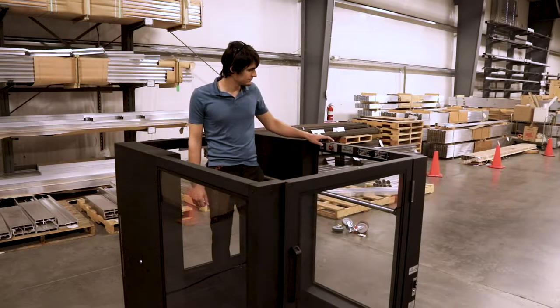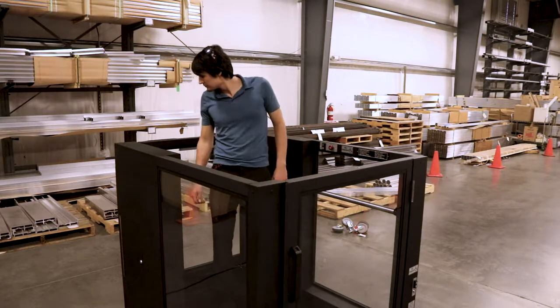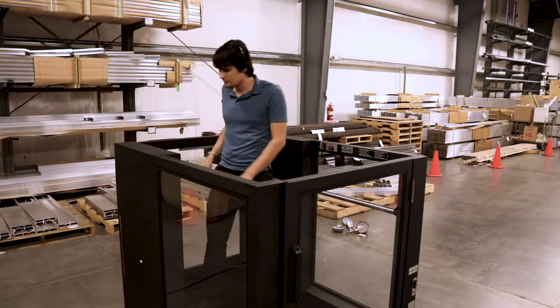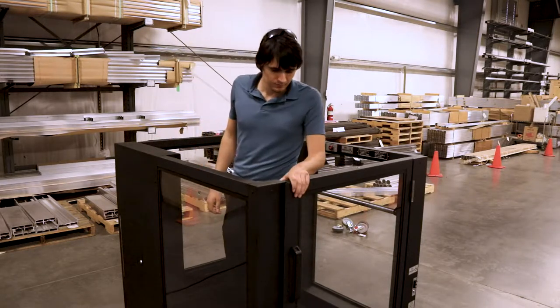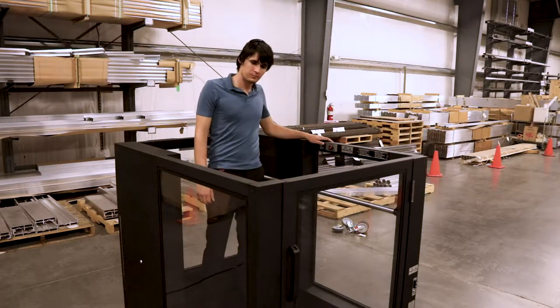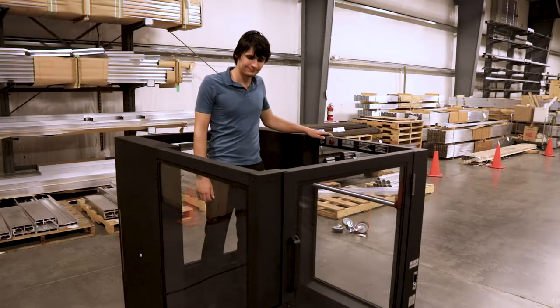Check to make sure that both gates are completely closed. The lift will not run if it senses that one or both of the gates are open. If the lift thinks that a gate is open, it can be because the gate is physically open, or it could be because the gate switch is not being properly actuated. See the end of this section for a brief description on where the gate switches are located and how they work.